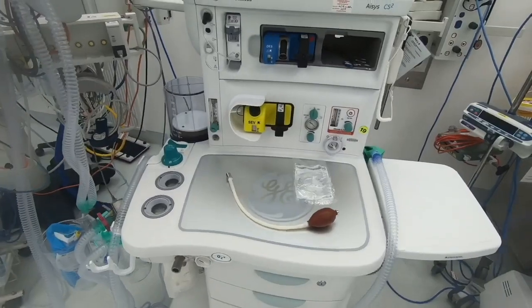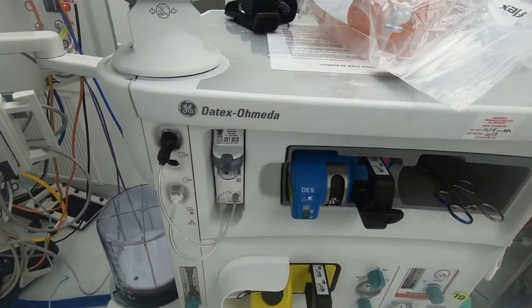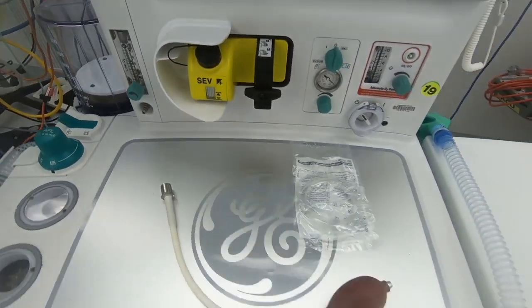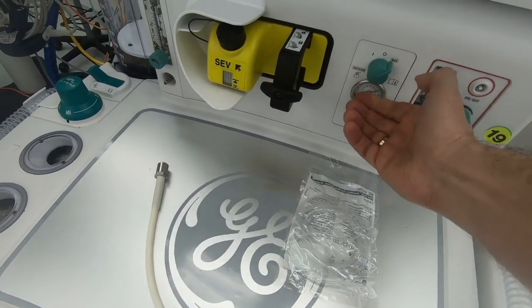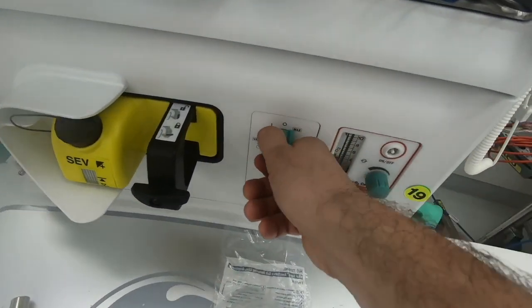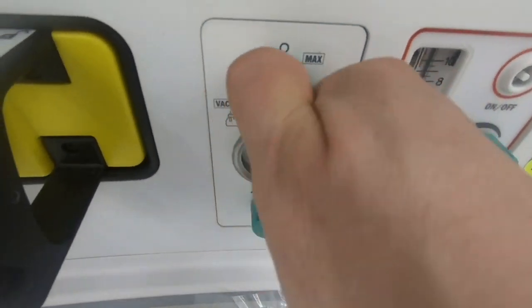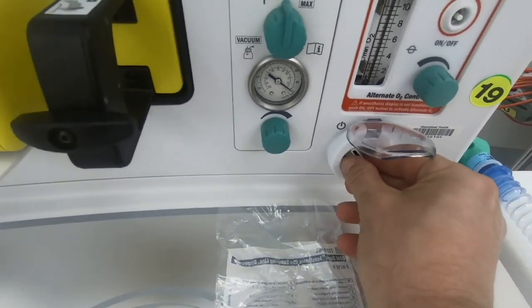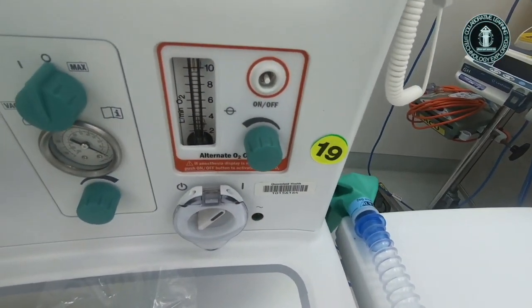Thank you very much. This is the front of the machine. This is the gas module. You can find the Aladdin cassette vaporizer. We'll come to that later. This is the suction. There is a maximum setting and an on setting where we can adjust the level of suction also. This is the knob. This is the master switch. This is the alternate oxygen control.